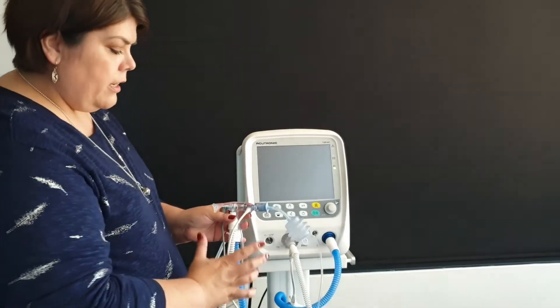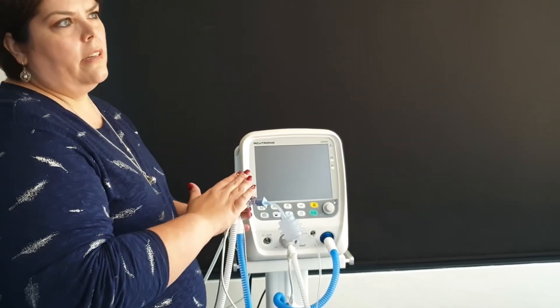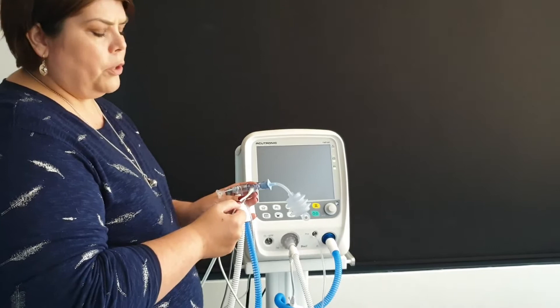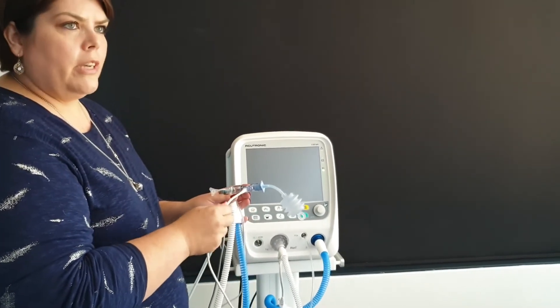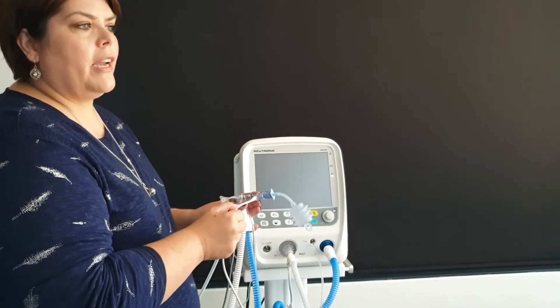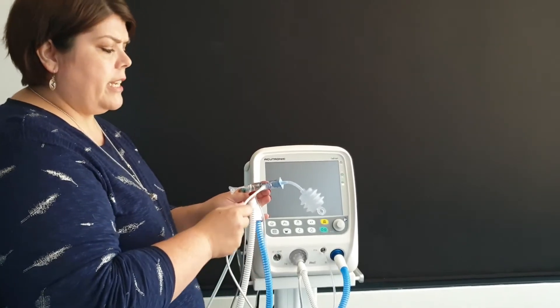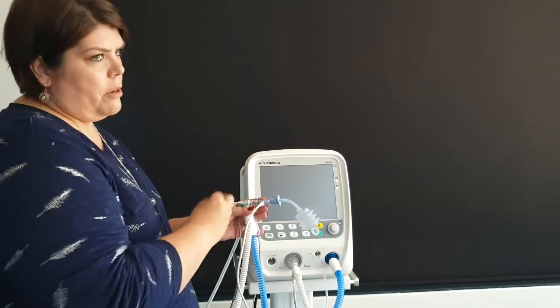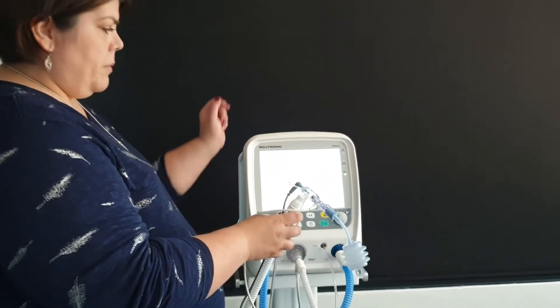I am going to switch the machine on to show you the calibration of the flow sensor. Calibration literally takes five seconds — if you can blink your eye it is already done, so there is absolutely no reason not to calibrate the flow sensor for every patient. If you calibrate the flow sensor you know your circuit does not have a leak and the values you get from the flow sensor are much more reliable.